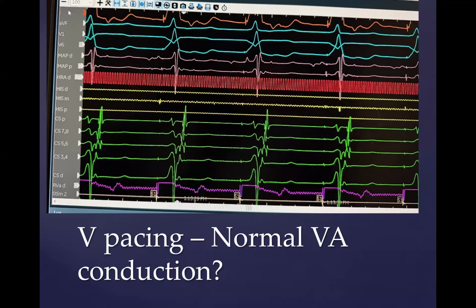So why don't we ask Dr. Bezdakova what she thinks? What do you think, Christina? Morning, Dr. Path. Just looking at this EP study, so we're V-pacing.